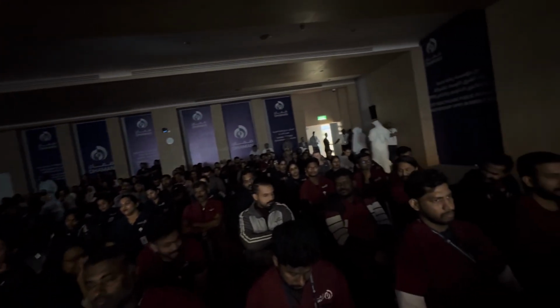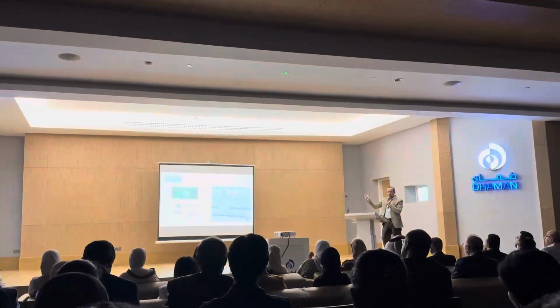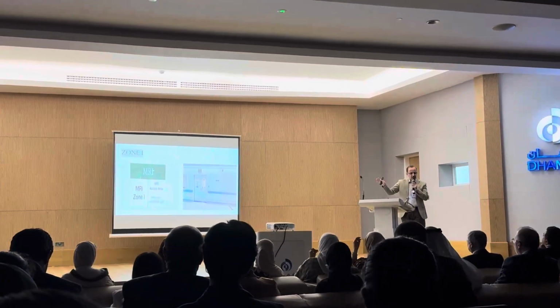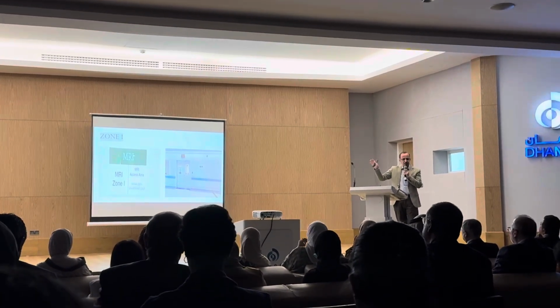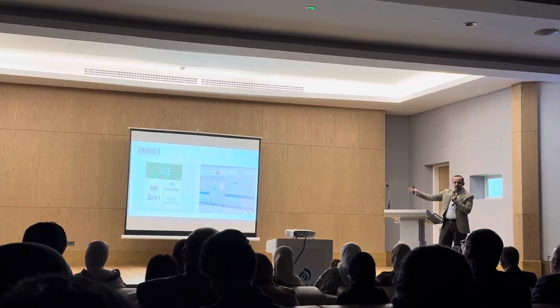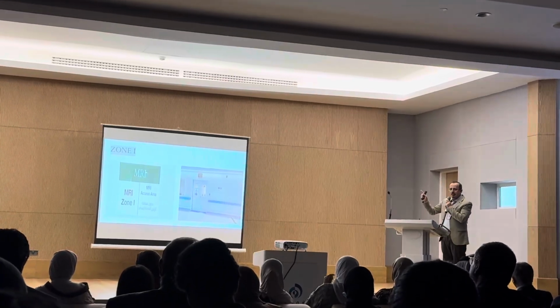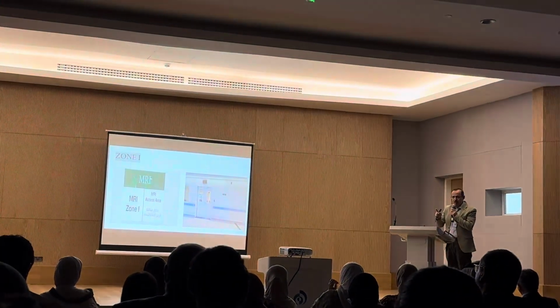Of course, we are following the parameters and guidelines of the RPD in this manner. By the way, the images are taken from our department, which I'm proud of, and I think it fully fits the safety parameters, so I can show it to you safely and with ease. This is the zonal division of the MRI environment.